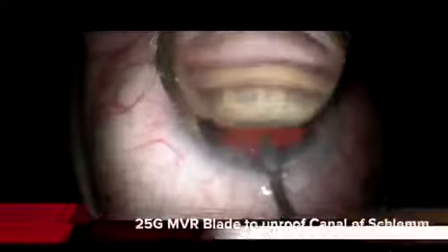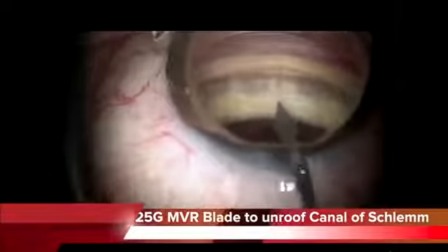I insert it under viscoelastic through the primary cataract incision. Now this is after we have tilted the patient's head and the microscope. I identify the canal of Schlemm. Note that the chamber is kept slightly soft so that there is blood helping us guide the position of the goniotomy. A 1.5 millimeter goniotomy is made in the trabecular meshwork, and just slightly lift up on it to see the blood egress so we know we're in the right position.